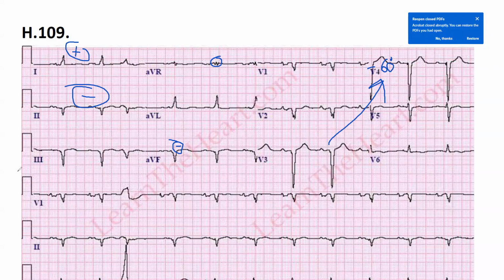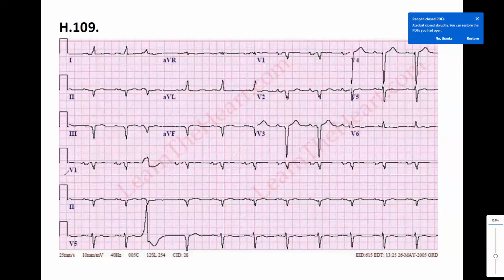Next, you deal with the pathological Q wave and hypertrophies, okay? I didn't see any pathological Q waves, so I don't think there's any hypertrophy. Well, look at lead number 3 and AVF and lead number 2. These are QS complexes, and that's not normal.